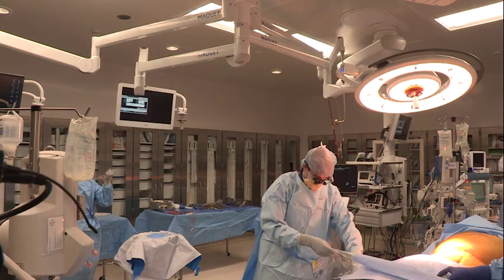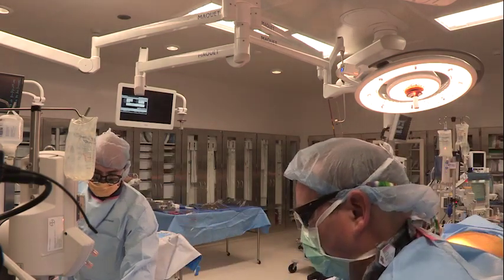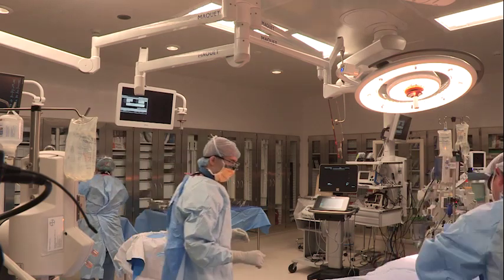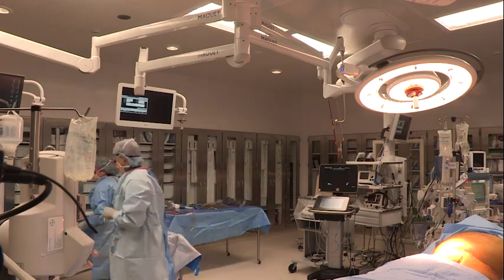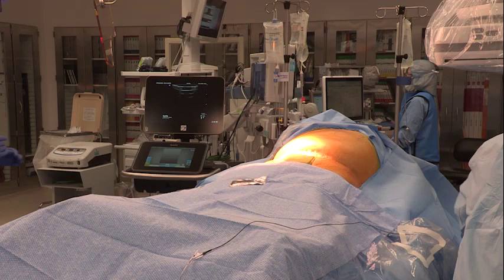To obtain percutaneous access, prep and drape the patient in the usual manner. Because EVAR cases require bilateral femoral access, prep both femoral sites as well. If not using general anesthesia, administer conscious sedation with intravenous midazolam and fentanyl. The box for the IVUS catheter may be placed by the patient's contralateral hip. This positioning may help avoid inadvertent contamination of the wire as well.